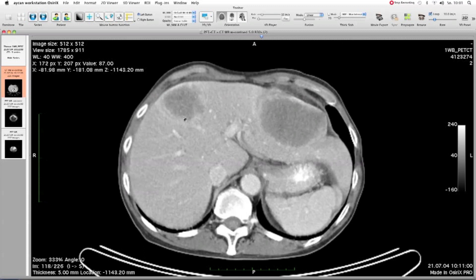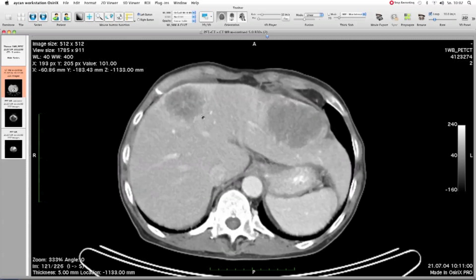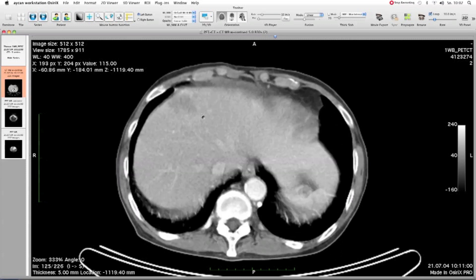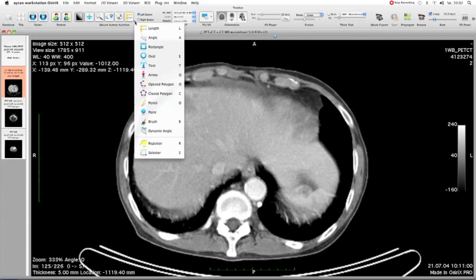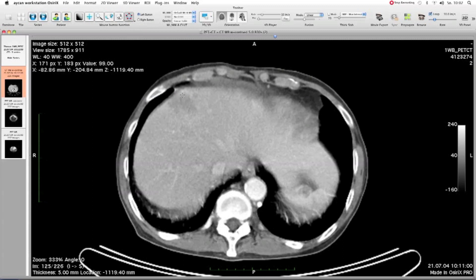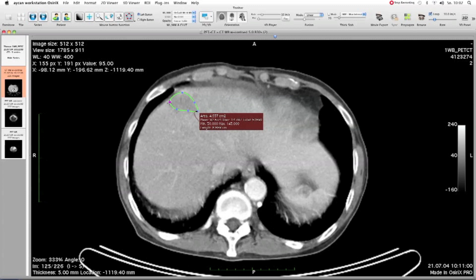I recommend that you watch what I'm doing first, and then after that you can repeat it — so just have a look. We go to the beginning of the lesion and use a tool called the closed polygon. I mark up and highlight the lesion, and on the last point I double-click to close the polygon.